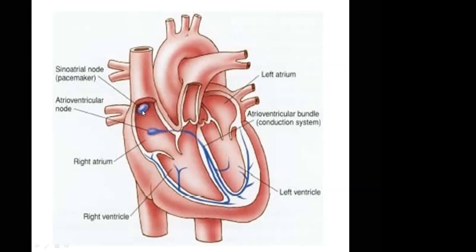So the catheters, when they're in the atrium or in the ventricle or whatever they are located in, apart from using them to determine or recognize electrical currents and the transmission of waves, you can also use that same catheter as a pacemaker stimulus to stimulate that segment. So if I put a catheter in the right atrium, close to the SA node, apart from recognizing the electrical activity generated by the SA node, I can also use that same catheter to stimulate the SA node.